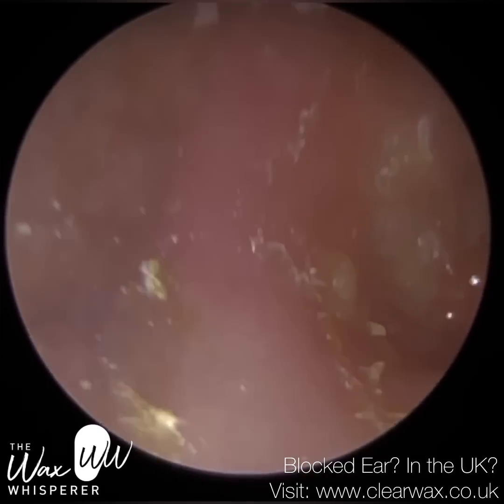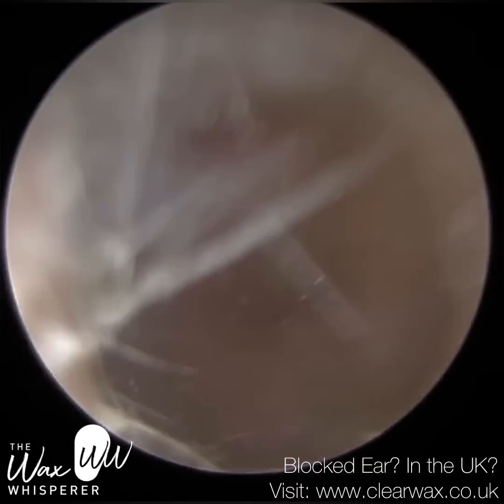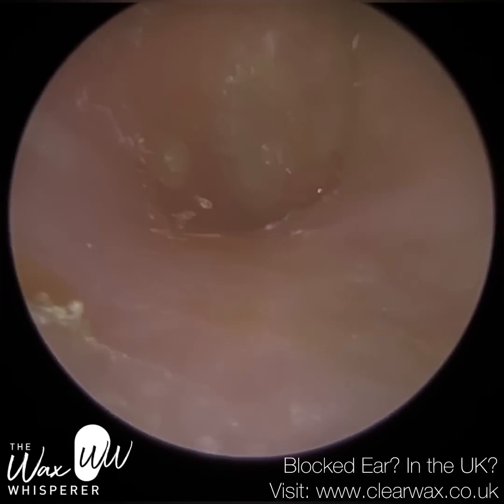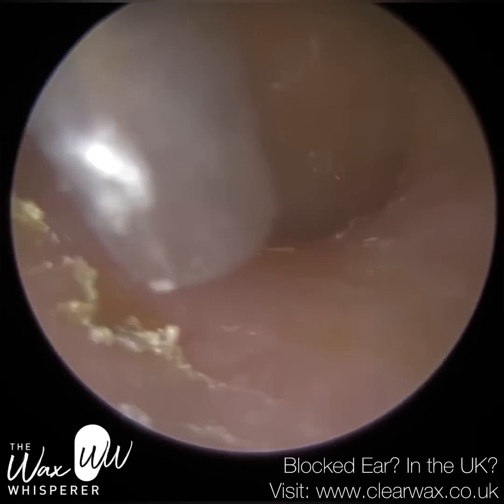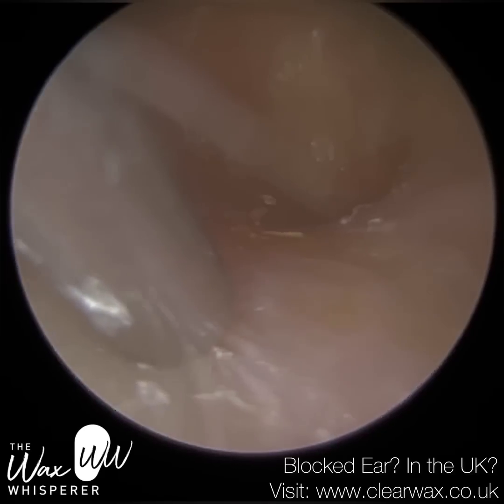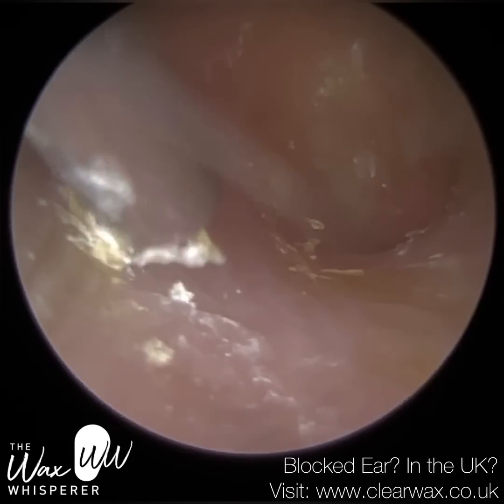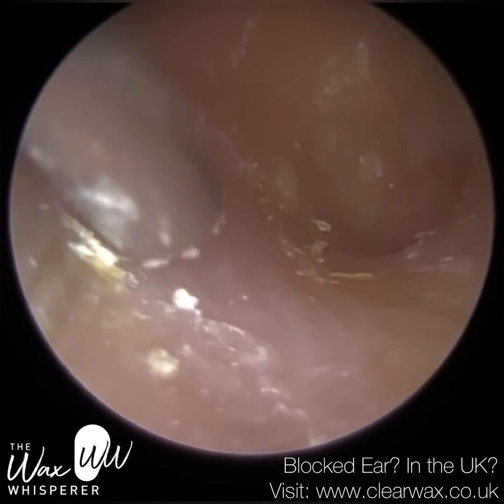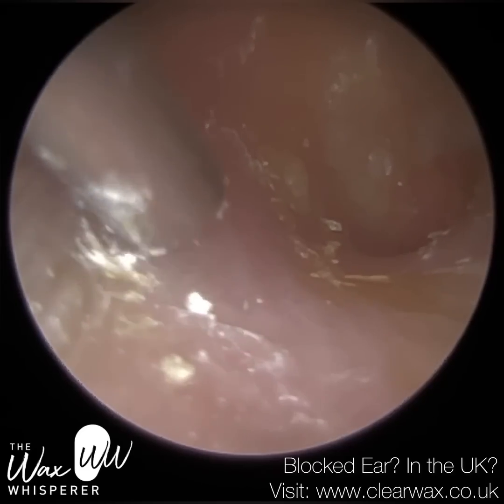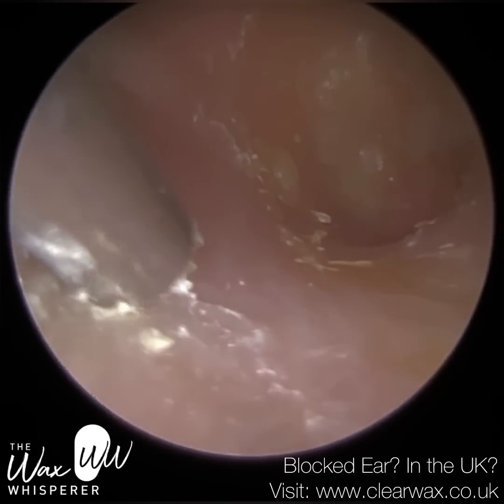I thought there was some, it's a bit darker shade, and I thought there was some keratin, but it's not. It's just a bit darker there. So probably a bit more, it could be a bit of inflammation there possibly. And I got them to do the valsalva just to confirm the presence of middle ear effusion. If there's middle ear effusion, either it's early stage or resolving, so when you've got fluid behind the eardrum, if you get them to do the valsalva just gently, you're essentially forcing air up the eustachian tube into the middle ear cavity, and you can get some air bubbles, and it can move around in the fluid.